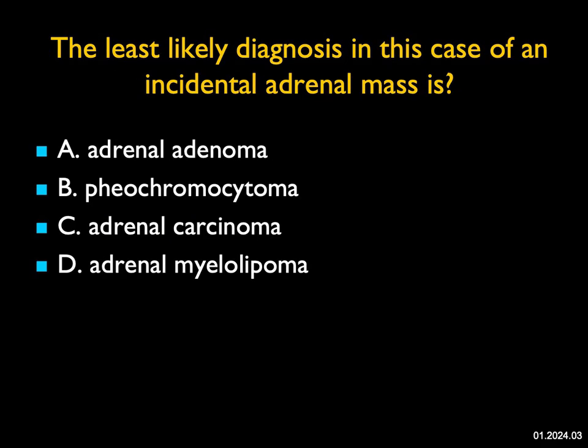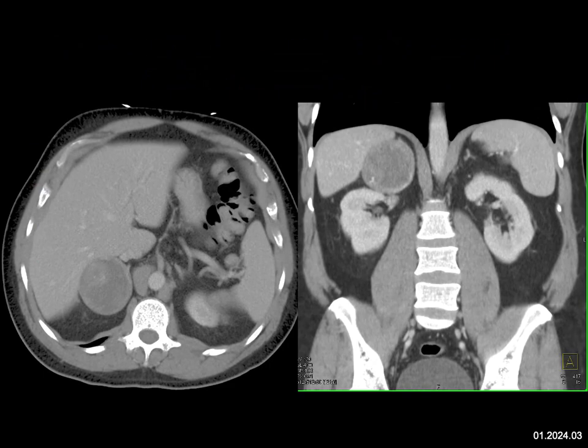The least likely diagnosis in this case of an incidental adrenal mass is? We see a right-sided adrenal mass — it's maybe minimally vascular, not very vascular, with a well-defined border. The contralateral adrenal looks good, and I don't see anything else in the abdomen — no liver mets, no adenopathy. This could be an adenoma, but the wall thickening and higher density make it hard to say it's a simple adenoma. Pheochromocytomas are usually more vascular, though not every pheo is hypervascular. Myelolipomas typically contain fat, but it's variable. If asked for the least likely diagnosis, I would say adrenal carcinoma — it's too well-defined, borders too sharp.